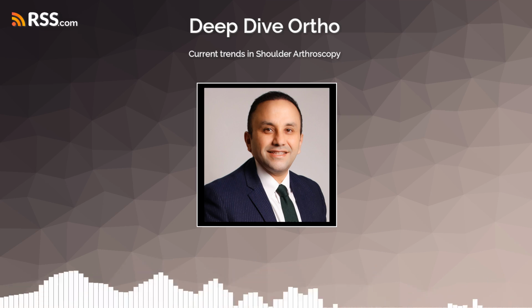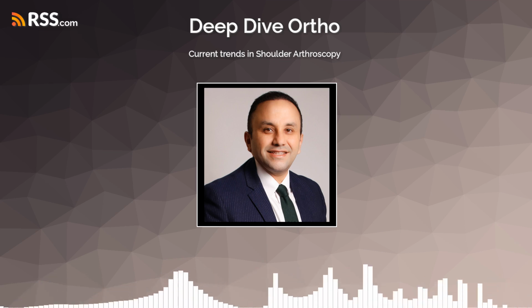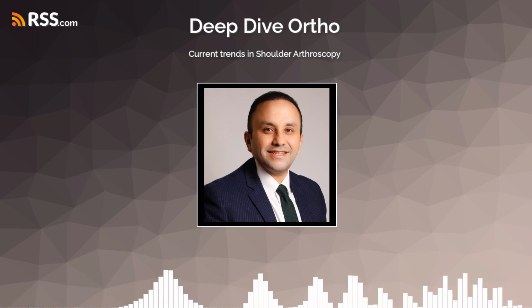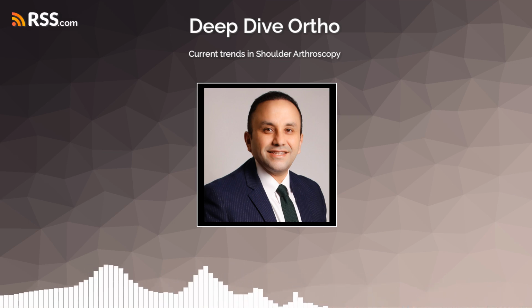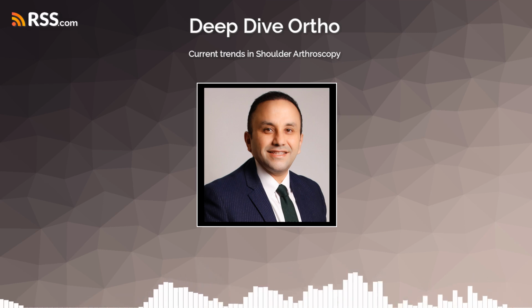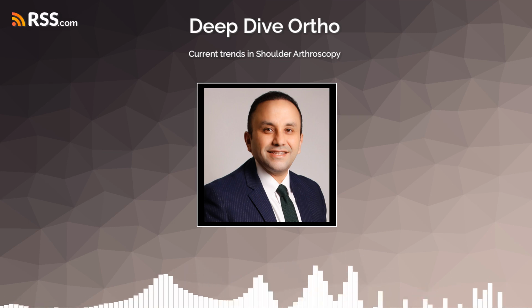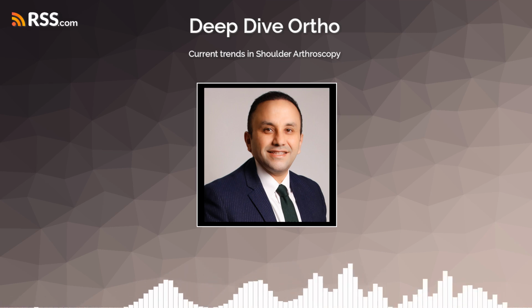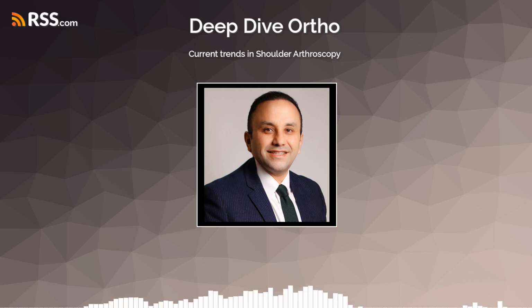Even bone cysts in the proximal humerus, the upper part of the arm bone, can be treated using minimally invasive techniques now. How does that work? Yes, endoscopic curettage is a technique used to treat certain benign bone cysts in the proximal humerus. Endoscopic, like arthroscopic, but inside the bone. Kind of. It involves making small incisions to create portals directly into the bone cyst, then using specialized instruments under endoscopic camera guidance to scrape out the lining of the cyst. The goal is to be less invasive than traditional open surgery, where you might have to make a larger window in the bone, potentially leading to faster healing and maybe a higher success rate in resolving the cyst.